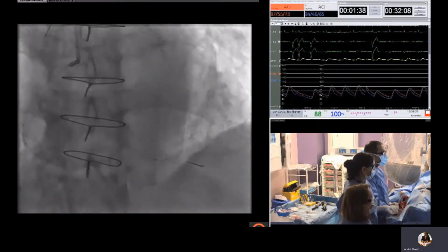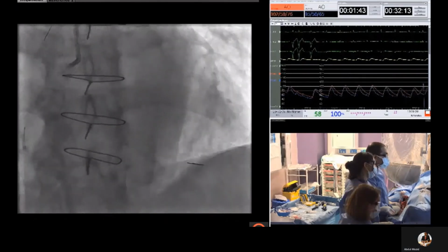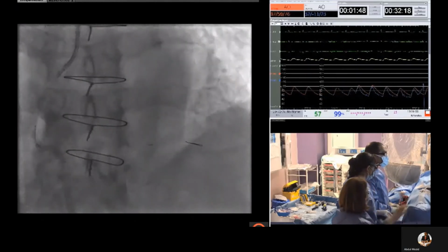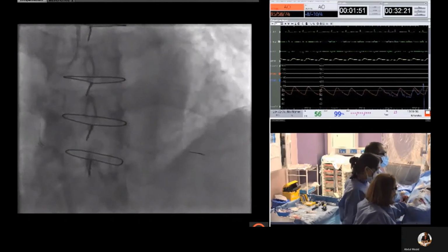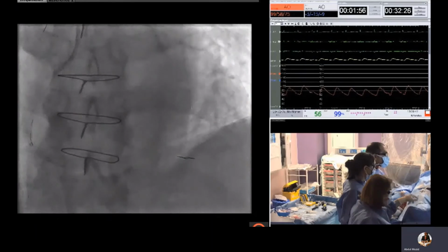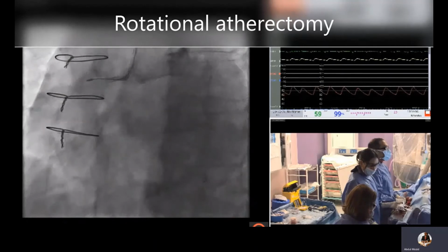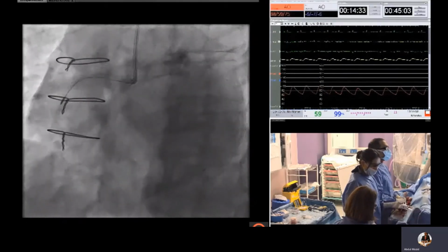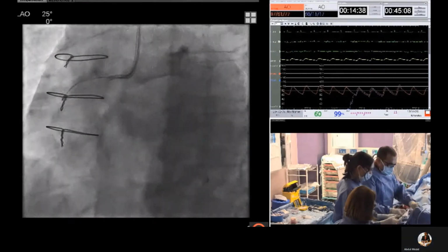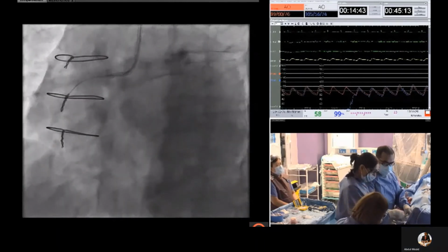So this is then the Rota floppy wire being delivered. And subsequently the microcatheter and guide extension catheter were removed and we proceeded to rotational atherectomy with a 1.25 millimeter burr. So initially we performed high-speed rotational atherectomy to the proximal to mid RCA.